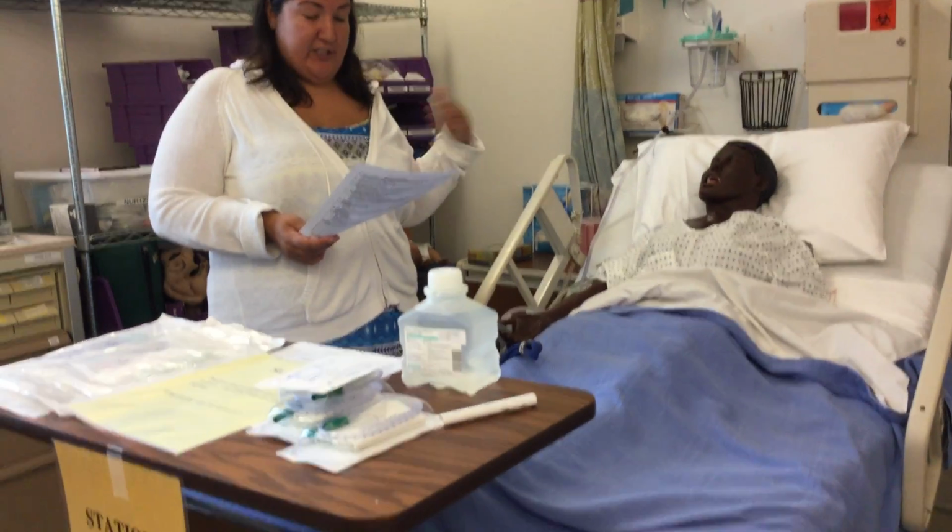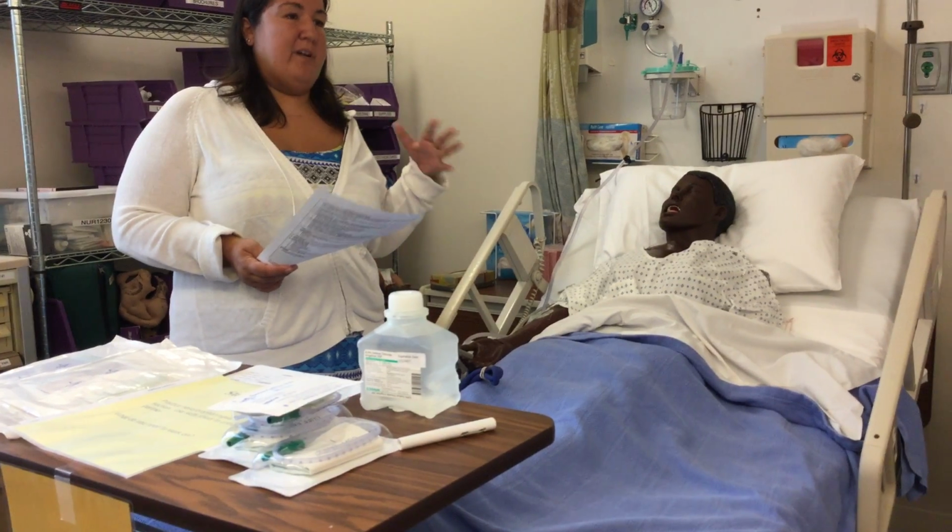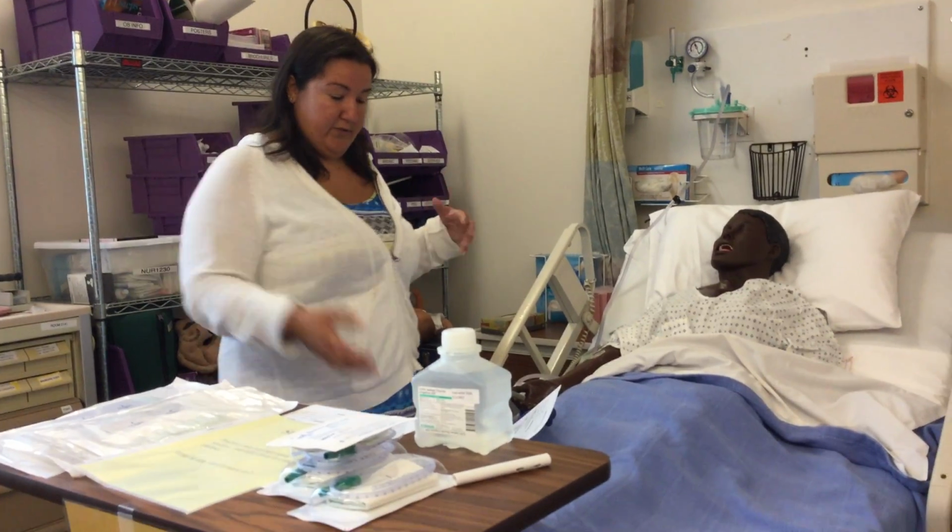You want to avoid distractions. You want to make sure you have an order for suctioning, because you should. Though a lot of places have protocols that cover you, so if your patient is drowning in their secretions, you're not going to wait to go call the doctor. Most places have some kind of protocol, but know that there is usually an order.